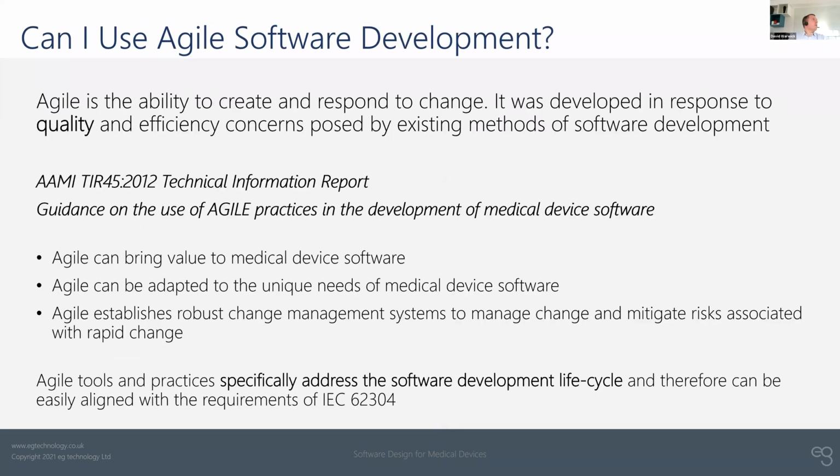Now, if you come from a software background, you might be thinking, well, can I use something like Agile software development? Can I use techniques like Scrum to develop my software? Because this is the kind of terminology and processes that software developers are more familiar with. And the answer is yes, absolutely, you can.